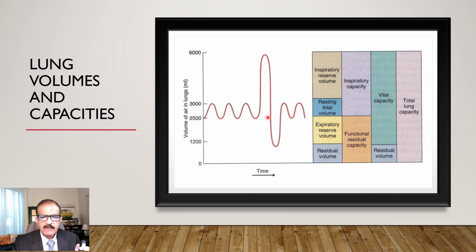Number one, although you have not restricted time in number of seconds, you have asked the patient to do it as fast as possible. The other thing is, when the patient does it with force, because of raised intrathoracic pressure, some of the small airways are compressed, and that actually reduces the total amount of air exhaled.